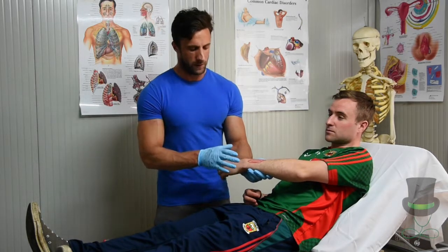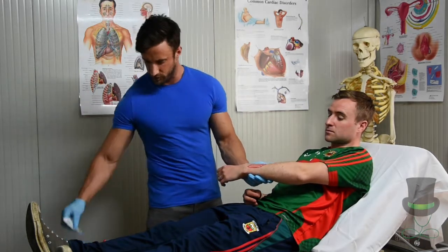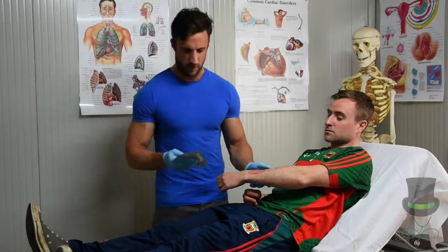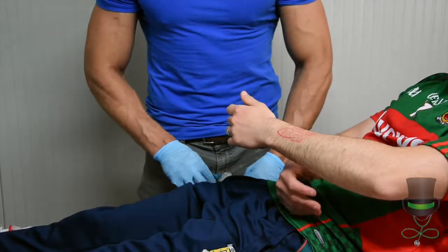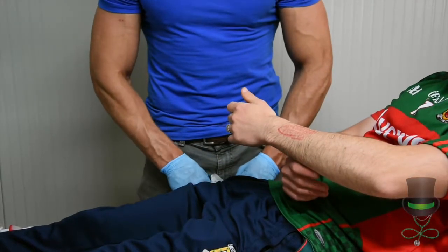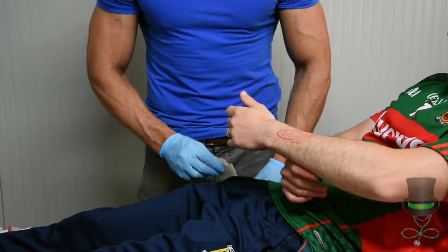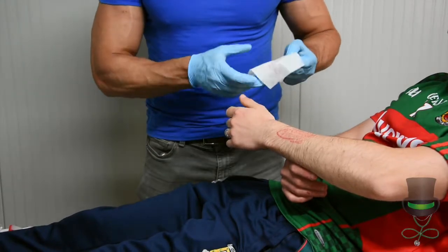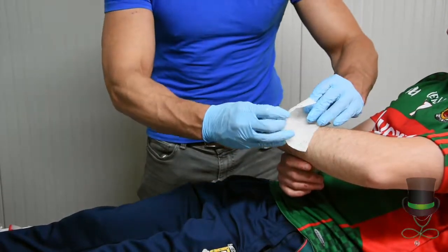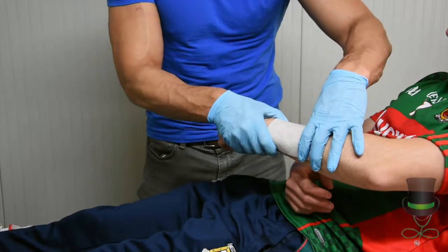Once you're happy with the wound, you can then begin to treat. Using your burn gel dressing, remove it from its packaging, open it out, and place it over the site of the wound.